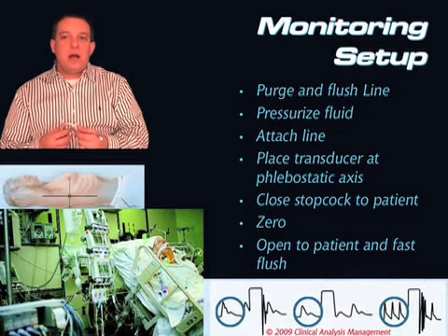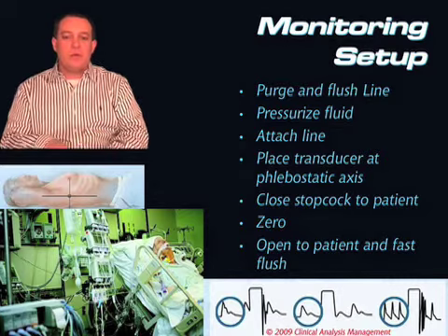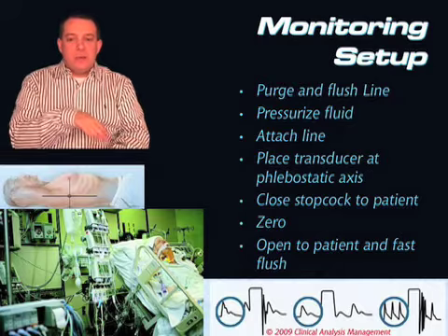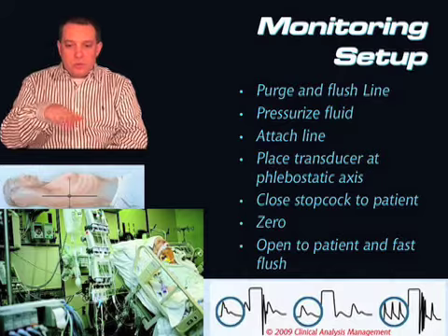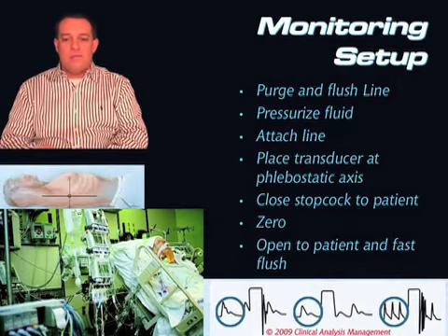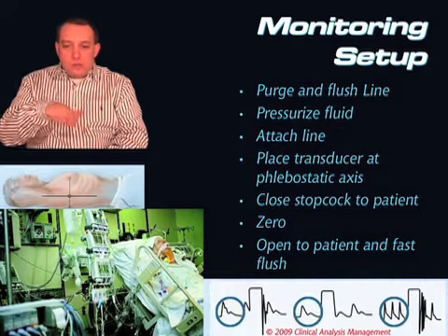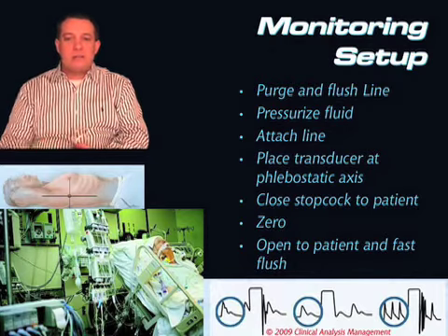When we talk about the underdamped system, remember that the underdamped system was too dynamic. There were too many bounces there. We would like to see two or three bounces, but we don't want to see that when we release the pigtail, we don't want to see it go zzz. We just want to see it go do-do-do and then back to a regular waveform. If it goes zzz and finally thins out, what that tells us is the system is too dynamic.